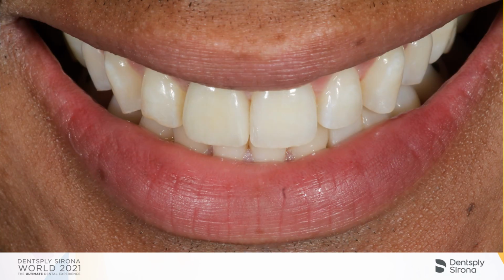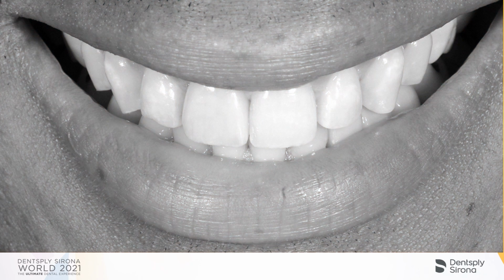If we take this image, and we aimed high, which you saw was a very high value restoration, and we turn it black and white, it looks very much the same as our opposing dentition. So aiming high will bring us to a nice lower value once we cement it in and get done with our staining and glazing. I think any old lady at the hardware store that I worked at in high school would be very happy with this color match.